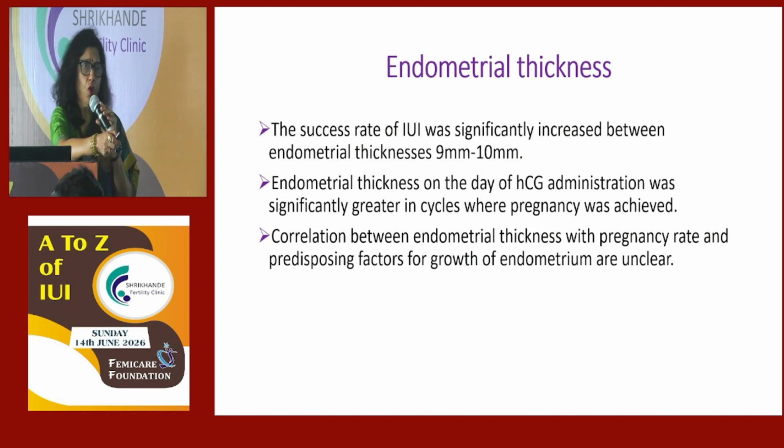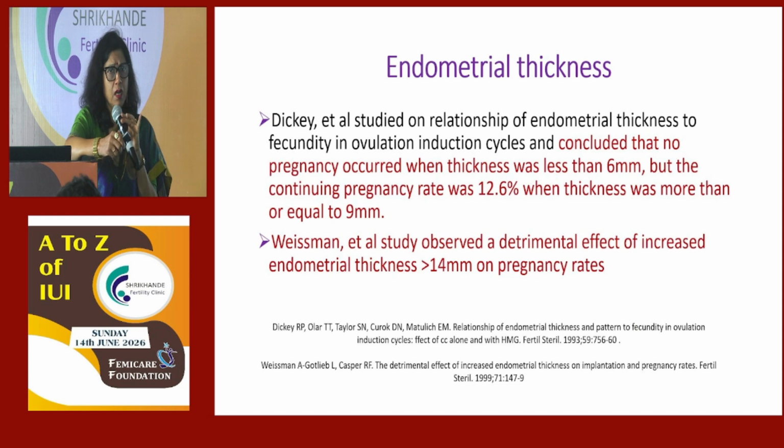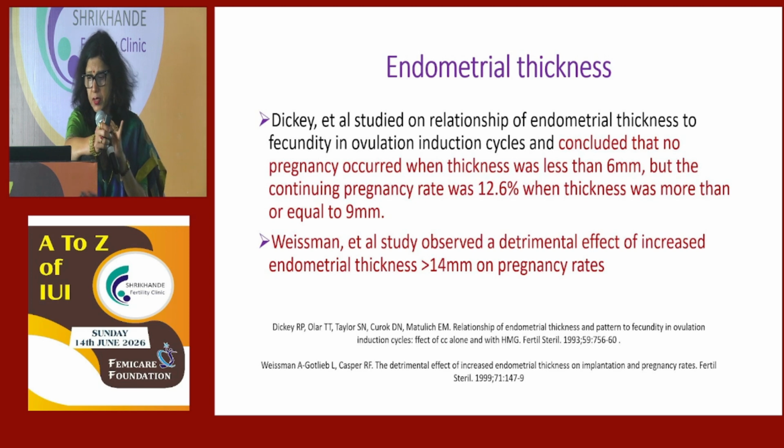So if you want to use color Doppler, every machine has color Doppler. You can just run the color Doppler and you can see how much of the circumference in the follicle has flow, and in which zone the blood flow is in the endometrium. But apart from whatever, thickness matters. It is the thickness we all are interested in.